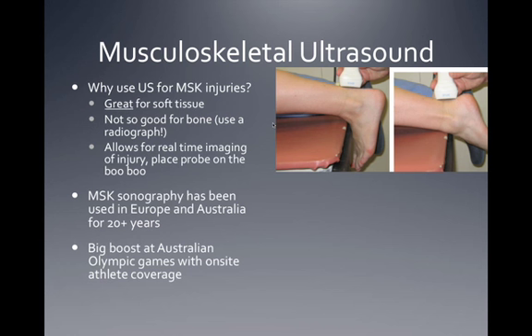But now other physicians are starting to pick it up, as well as physical therapists. Physicians are starting to use it for guided injections. Okay, and you'll see when we use our machines, we have some needle placement guides, and you can find the target tissue that you're looking to inject, maybe some anti-inflammatory medication, and put that medication right on target. So it's great for that.